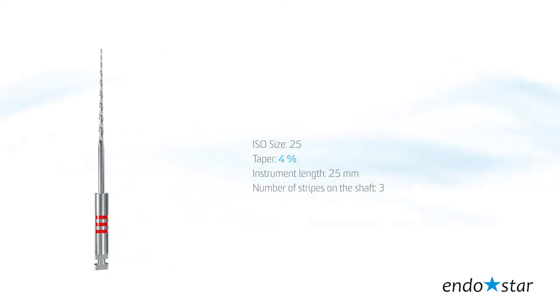File number 2: the tip size reflects 25 according to ISO standards, taper 4, instrument length 25 mm.